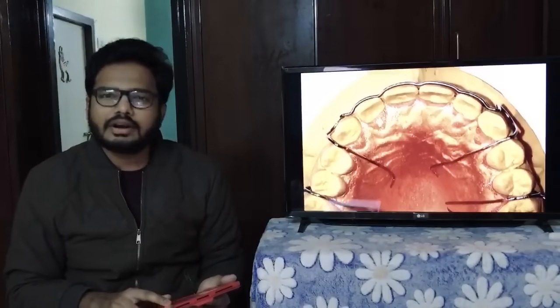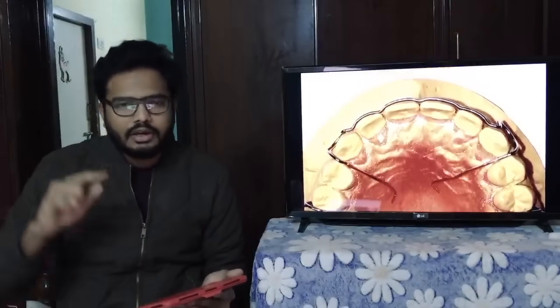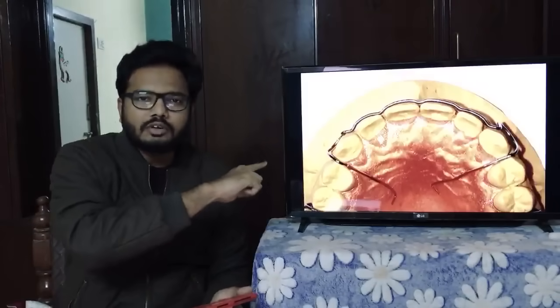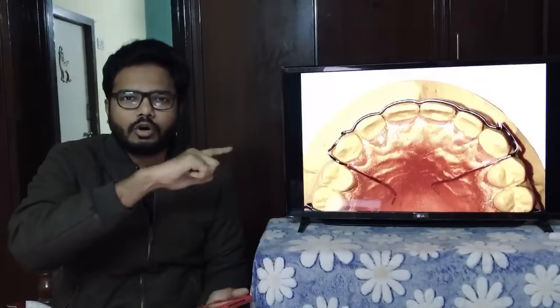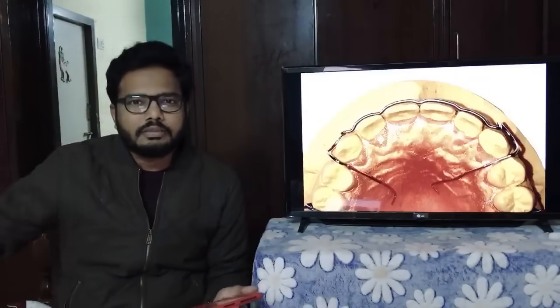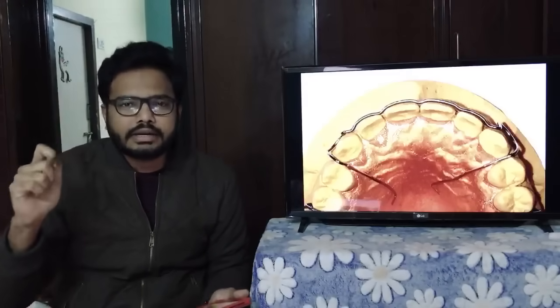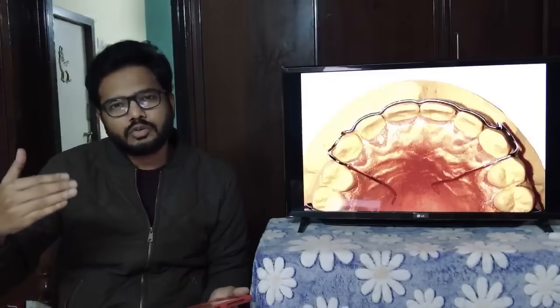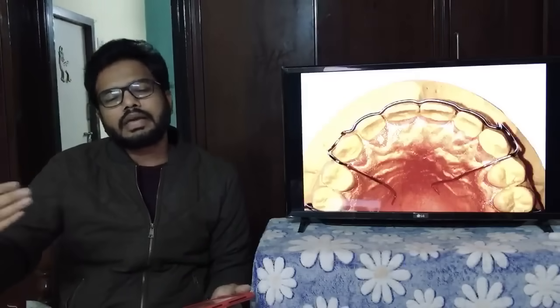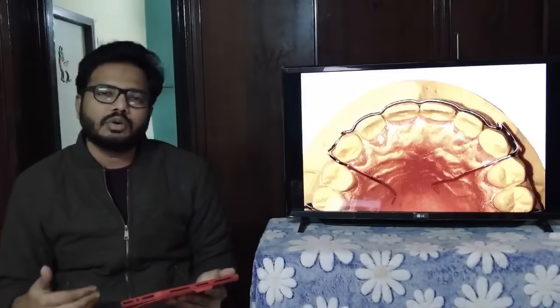Yeah, it's used for retention after completion of fixed orthodontic therapy. Can you observe the contour of your labial bow or the outline of labial bow? It seems to be following the contour of the labial aspect of incisors as well as canines. It's called a fitted labial bow. It's not used for altering the position of a tooth. Rather, it's more or less used for retention once fixed orthodontic therapy is completed.